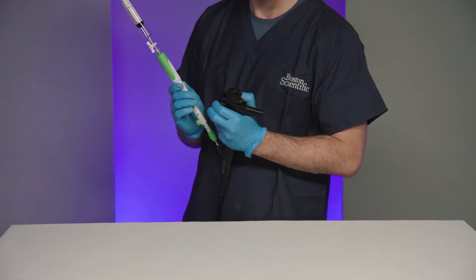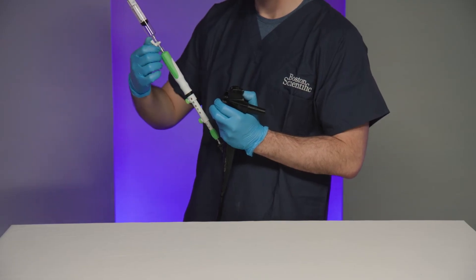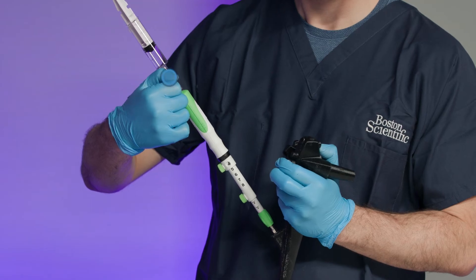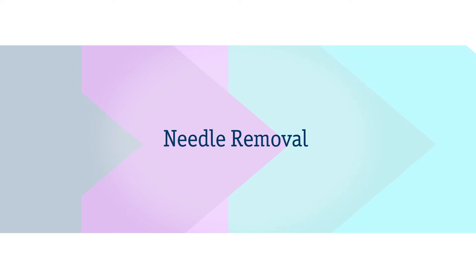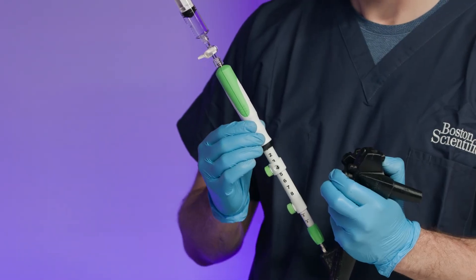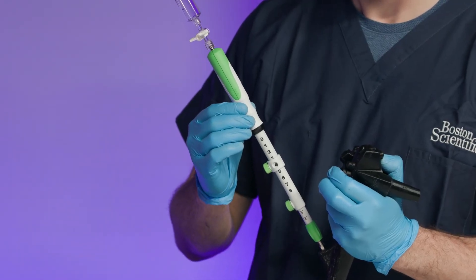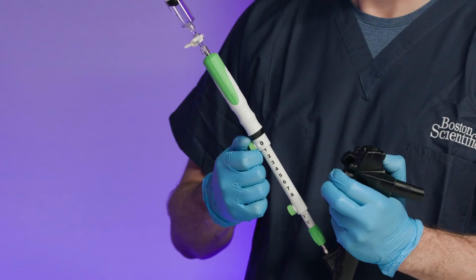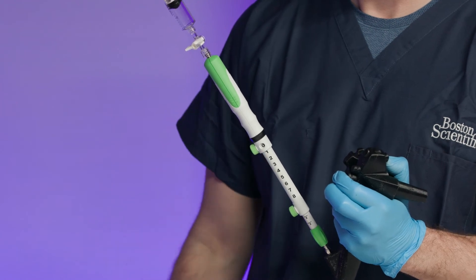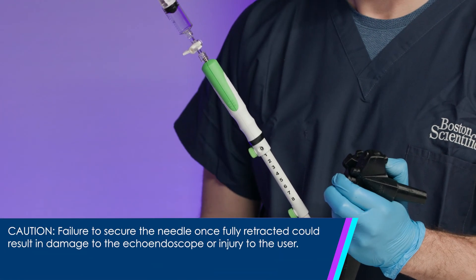After an adequate number of passes have been made with the needle, stop the suction by closing the stopcock by rotating until it is perpendicular to the syringe. Retract the needle fully into the sheath using the device handle by sliding the handle away from the echoendoscope until it stops moving. Secure the needle using the needle adjustment lock prior to withdrawing the device from the echoendoscope. CAUTION: Failure to secure the needle once fully retracted could result in damage to the echoendoscope or injury to the user.